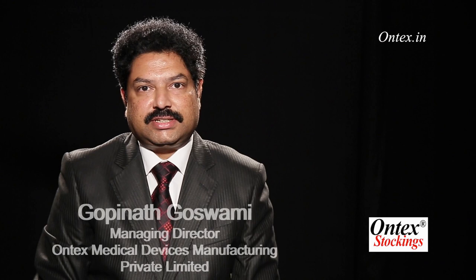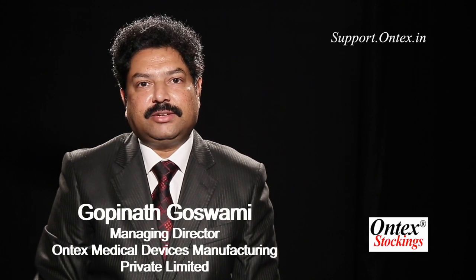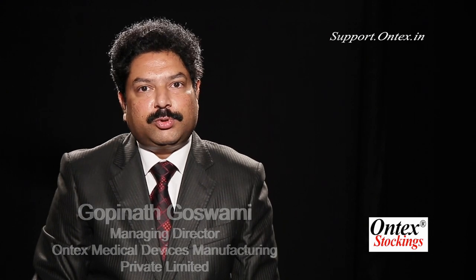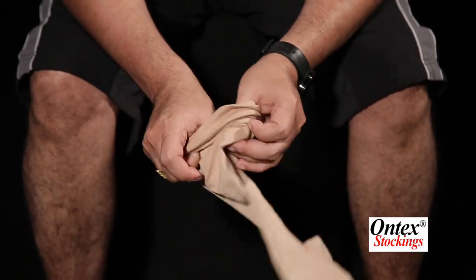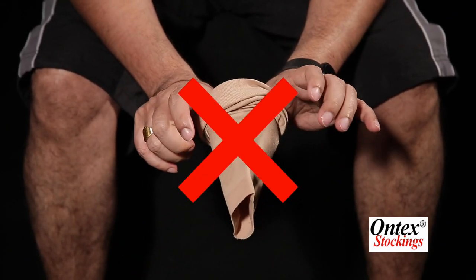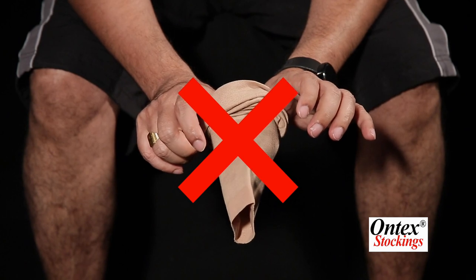It's a good idea to order two pairs of compression stockings, because when one is under laundry the other can still be used. There is a correct procedure for using compression stockings. There is a tendency to use them just like socks by bunching up, but if you do that it is almost impossible to wear them correctly.